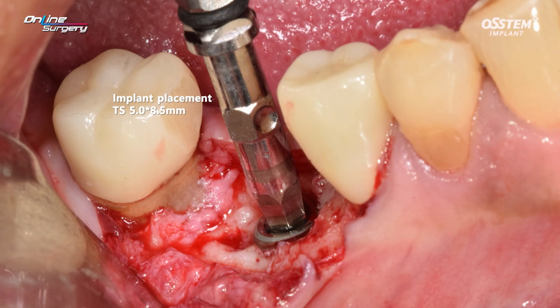The drilling would be performed. After drilling, the implant can be positioned. As I said before, an implant driver can be used to determine the final implant position. The problem here is that the bone levels on the lingual side and buccal side are different.